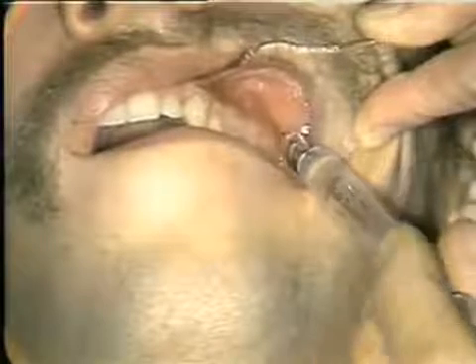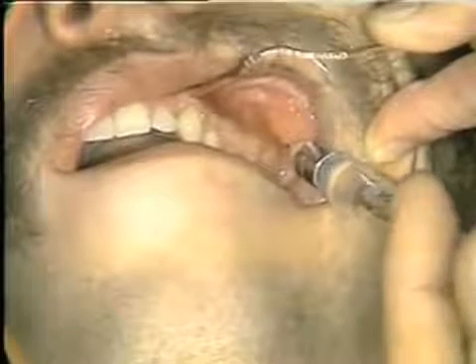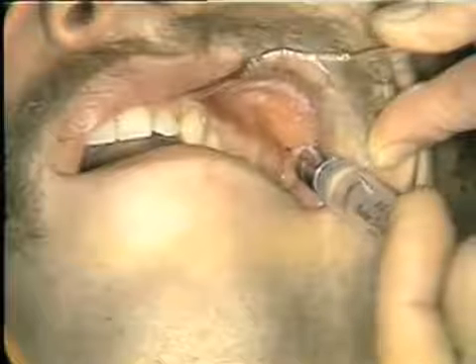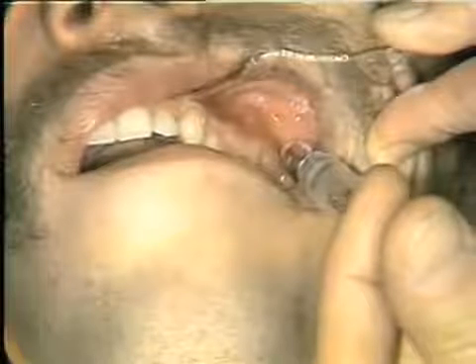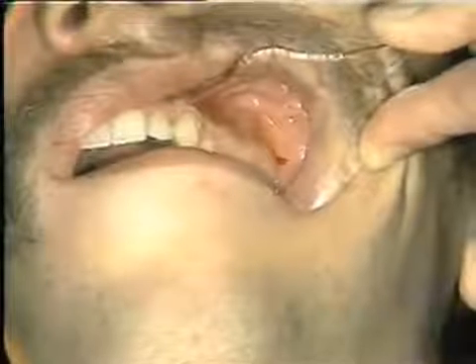All right, we'll aspirate here a little bit. We're in good position. And now we will very slowly deposit about 2 cc's of solution. And this should be adequate for the posterior superior alveolar injection. The posterior superior alveolar injection is a distinct advantage. We'll let Andy close here for just a moment.